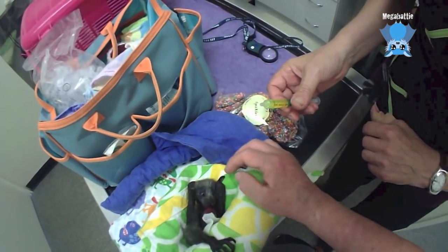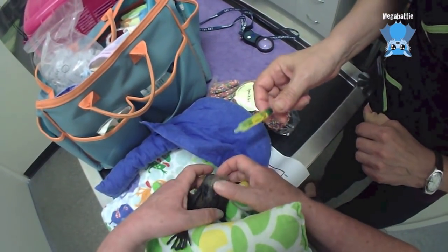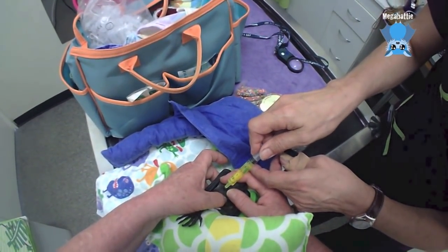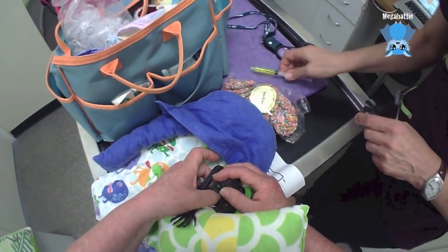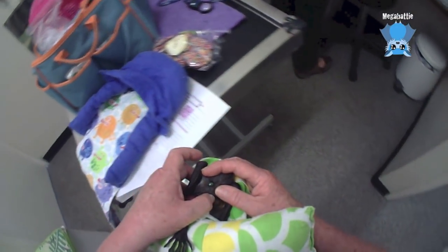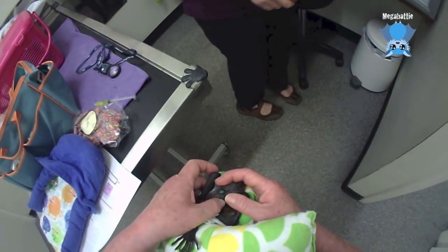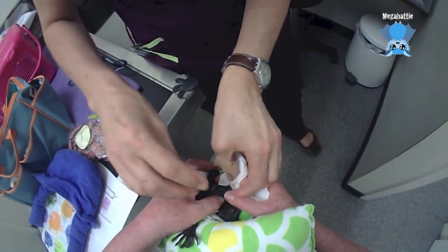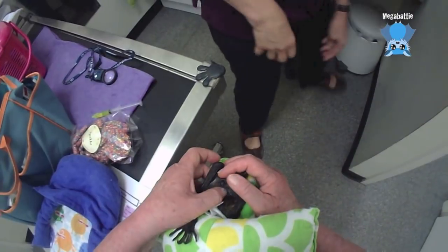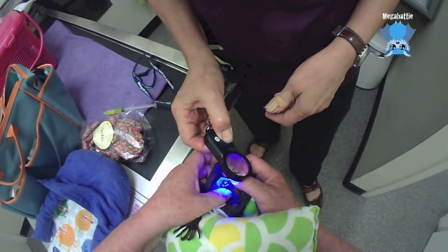I reckon she's a head injury — see how flat she is, she doesn't even want a drink. This eye was completely gummed up when I got her. Let me clean that out, I'll rinse it a little bit. She doesn't really have an ulcer.